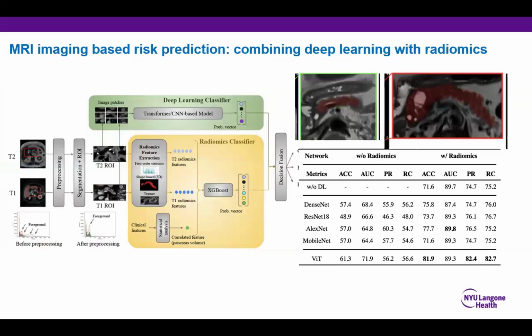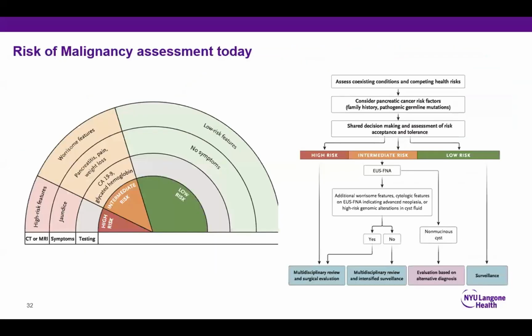This is the other part of the future, which is AI-based diagnosis in radiomics. This is a large study called the CystX Consortium that we have participated in, and that has developed an entirely MRI-based, now automated segmentation and diagnosis approach to identify and categorize cystic lesions, both for severity and for cyst type. This is a large database that's now made publicly available, and that we're continuing to mine to be able to offer non-invasive diagnosis. What about risk assessment?